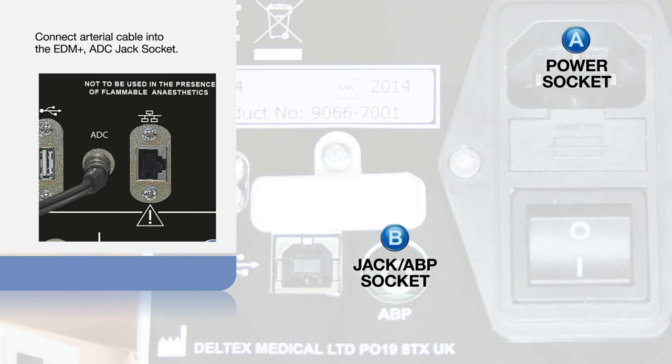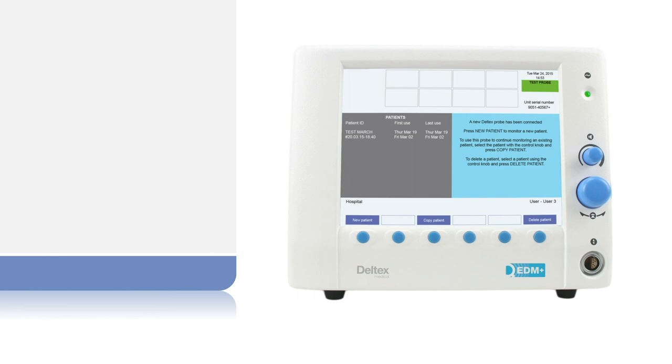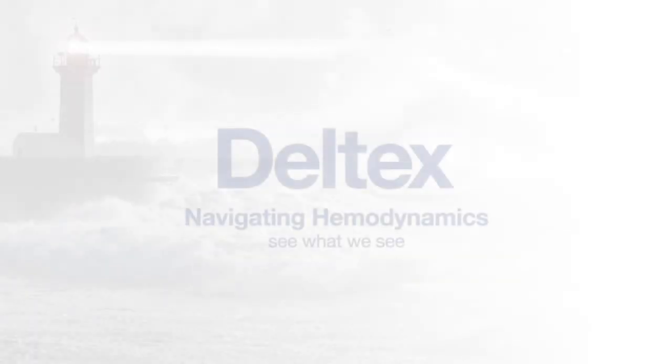The other end of this cable is plugged into the back of the monitor. The power switch is found here. Plug the patient interface cable into the front of the monitor. Your simulator is now ready to use. Step 2.